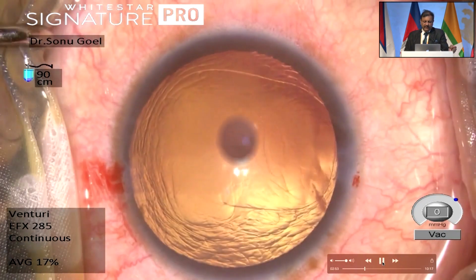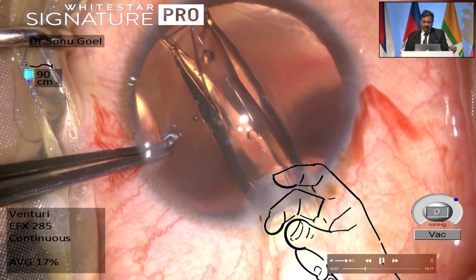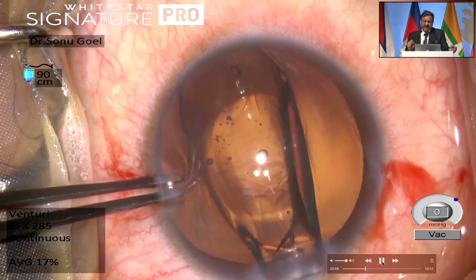Never overfill the anterior chamber. It should be just adequate. And this is what I want to describe here. It's in your hand, the rotation. So it could be clockwise or anti-clockwise, the injector. You should always have a good hold and a good grip onto the injector delivery system. And then while pushing slowly, you can manipulate the lens with clockwise or anti-clockwise rotation so that the lens unfolds in the correct direction.